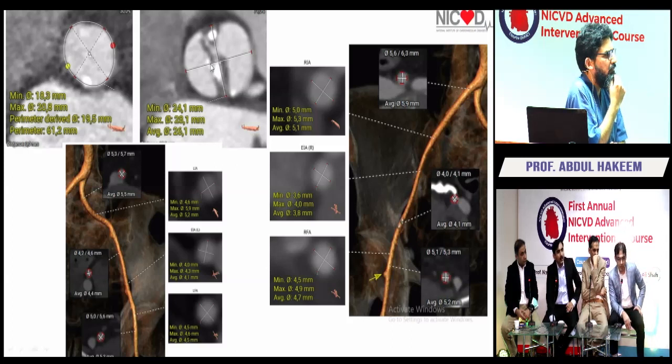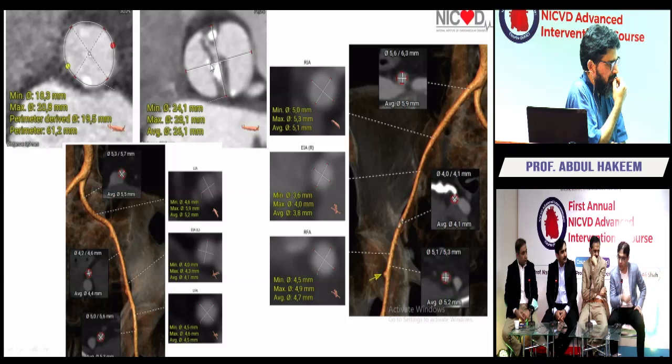And we are having an option of antegrade approach, just go through the venous access. So then the transapical is more of a historic nature. Now it's an open surgery, very high risk. The direct aortic approach, then the transcaval approach. The transcaval approach, again, in some centers, for example, Emory, is the number one alternative site. It's just like transfemoral, but you are going through the vein. But there are some cost issues associated with it.